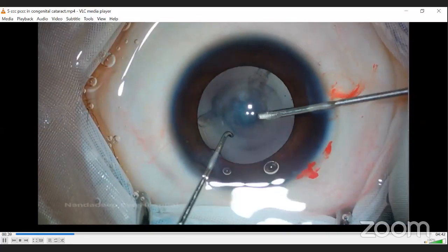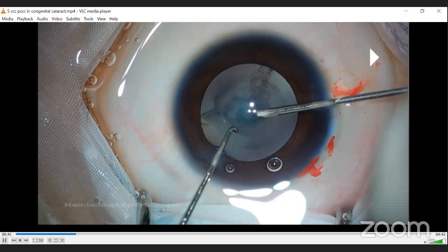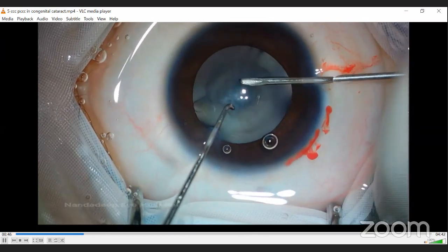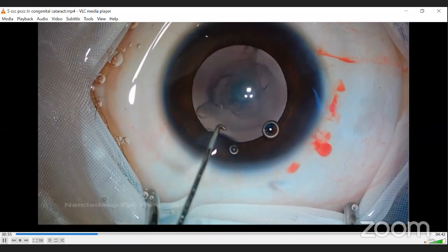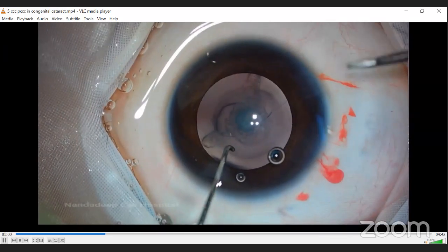The OVD of choice for me is 1.8% sodium hyaluronate. I think it is extremely important to use a good OVD, particularly in pediatric cataract, because CCC is the main essence of pediatric cataract surgery. Again, I'm using the side port incision, first creating a nick using the cystitome. You can also continue with the cystitome, but I find that control over the capsulorhexis edge is better with micro capsulorhexis forceps.